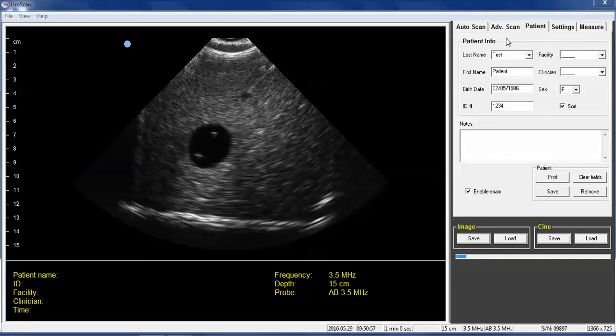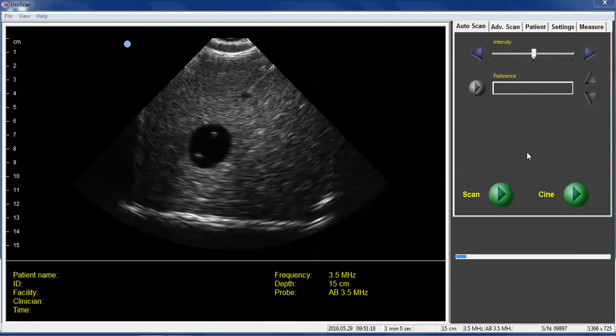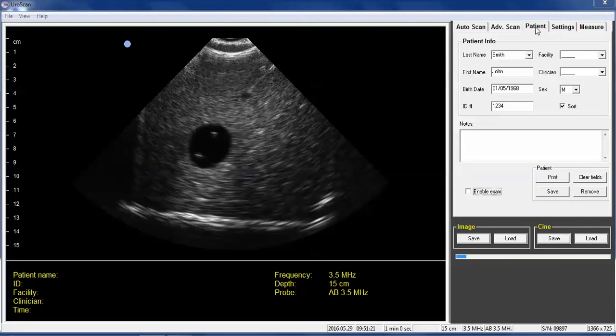Enter patient demographic information here. You can also remove patients here by selecting the patient based on last name and clicking the remove button. You also want to make sure that on this tab the enable exam option is checked off. If that is not checked off, then on the UroScan tab that patient exam box disappears and you cannot do patient exams. You can just take images, and we want to do more than just take an image. So we want to make sure that that enable exam feature is checked at all times.